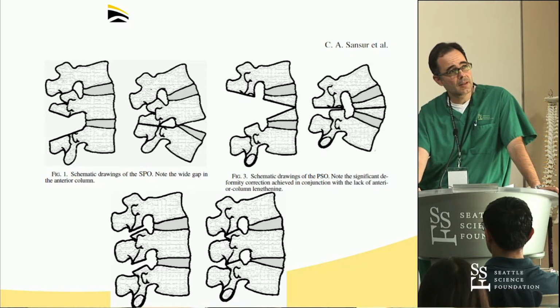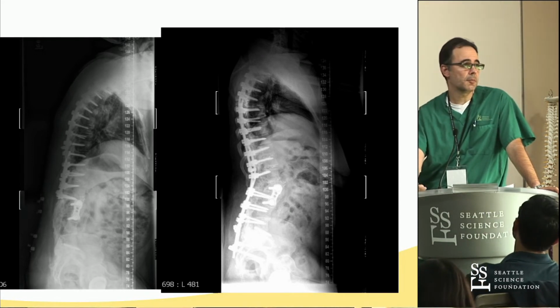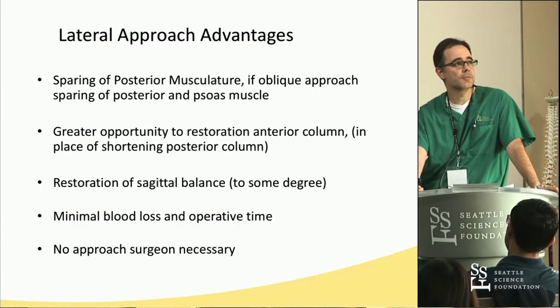Just a depiction of pre-op and post-op, showing the improvement in her alignment. And 2 years out, still no issues.